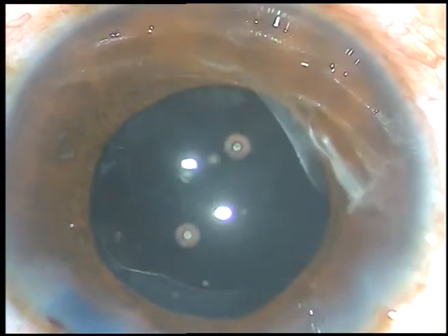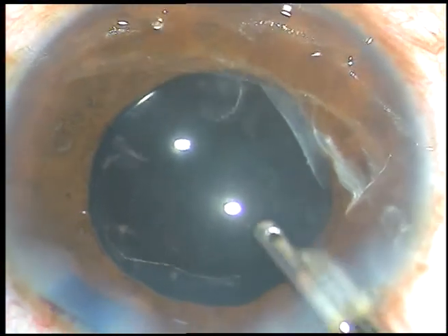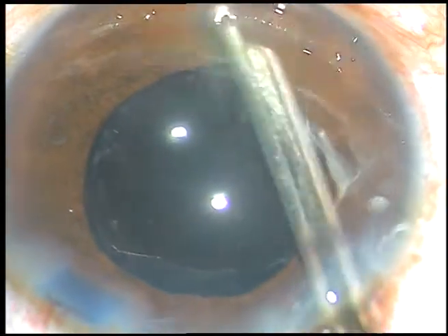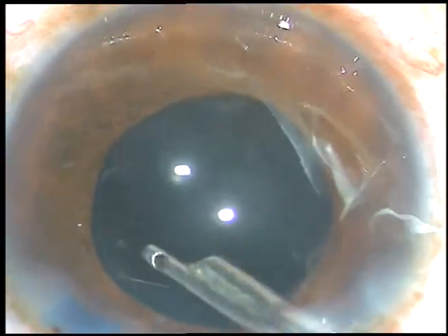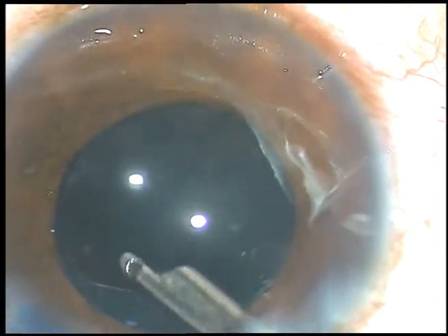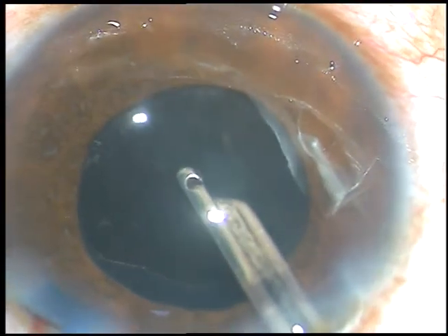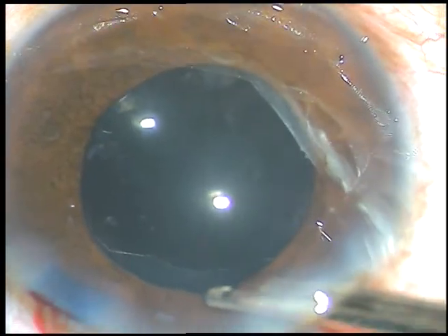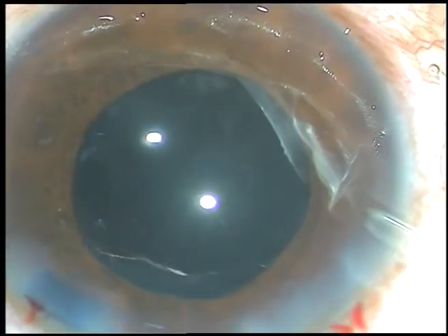So, the message which I want to pass in this video is: if you feel that the rhexis is small, you can enlarge it after implanting the intraocular lens. Thank you very much for watching. I hope this video will help you in your practice.